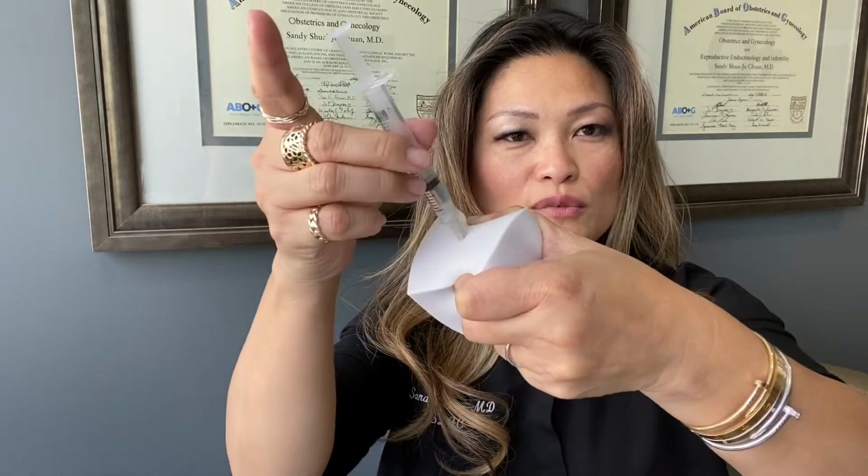This is a little bit more fluid, and this is obviously not your flesh, so I'm not going to keep pushing all the way through, but you understand what I'm saying. So that's your Gonal-F and your Menopur, and then you're done for that evening. For the first part of your IVF cycle, you're usually just going to be doing the Gonal-F and the Menopur, and then obviously mid-cycle you will be adding some additional medications.